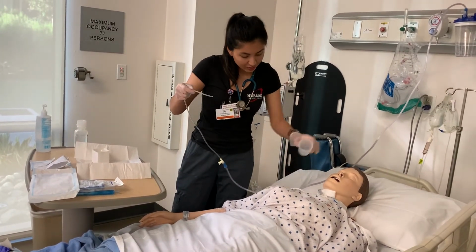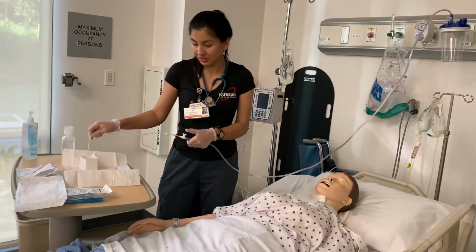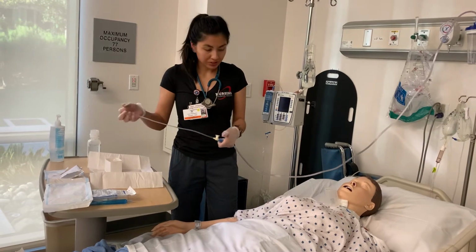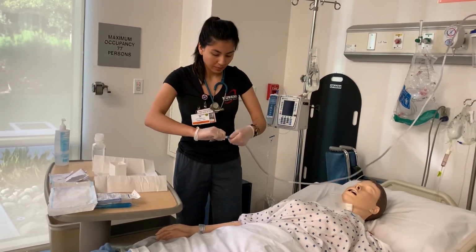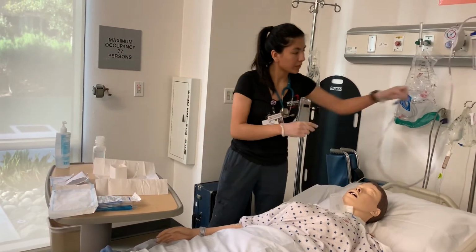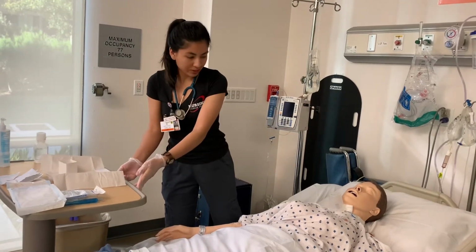Jane, how are you feeling? Are you feeling a little better? Yeah, I do feel better. Thank you. Alright, that sounds good. If she wasn't, I would continue to suction as needed. But since she said she's feeling okay, I'm going to go ahead and take this off. And then hang it up here for now. And then at this point, I don't have to be sterile anymore because she's all covered.